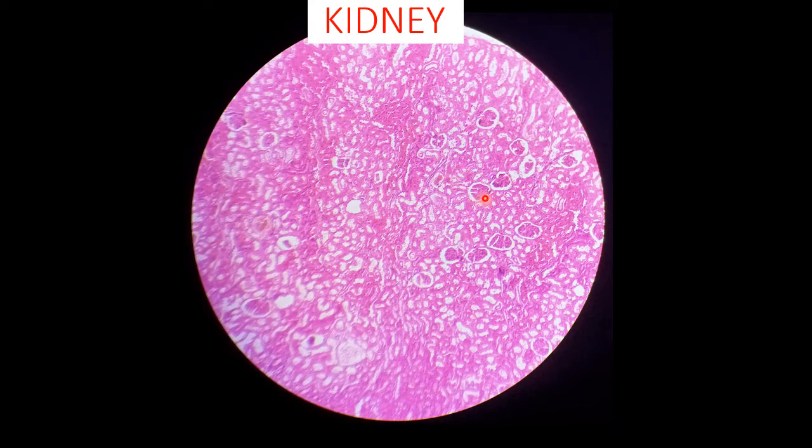In the outer cortex, it is consisting of renal corpuscles. This is a renal corpuscle, and sections of proximal and distal convoluted tubules. These are all the small tubules. And this is the Bowman's capsule and glomerulus. Okay, so these are all the structures which can be seen in the outer cortex. Then in the inner medulla, we can identify sections of collecting ducts and the loops of Henle, which can be seen in the medulla part of the kidney.